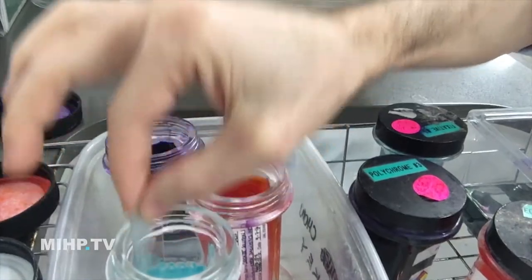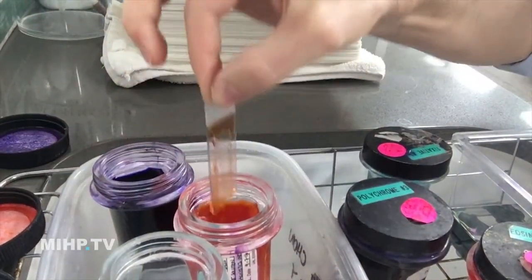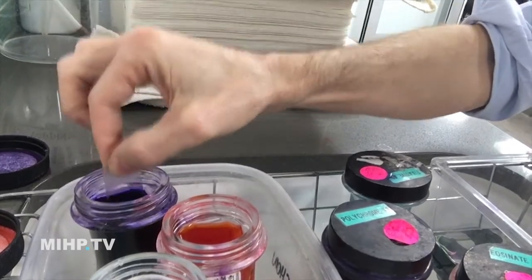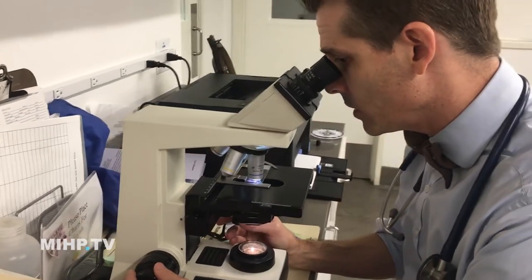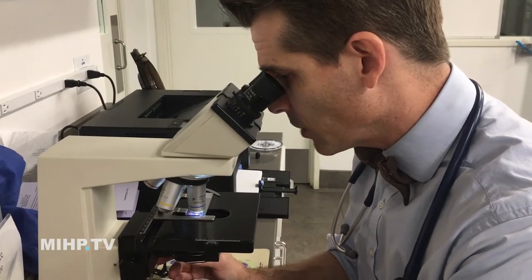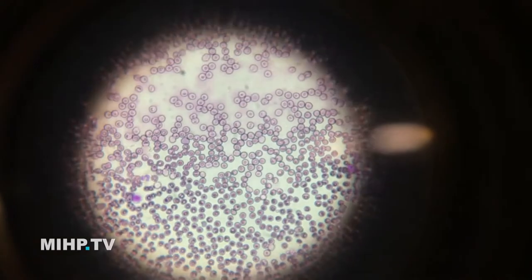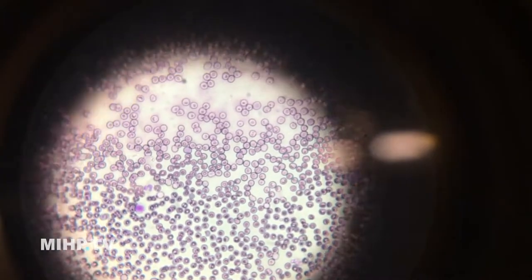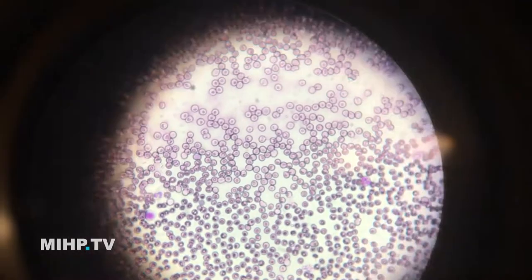So we'll look at it and see what it is. I'm gonna stain it. Oh, this looks like peripheral blood mostly. What is that? Just blood that you might get like in a vein or in a sore of some kind, so it might not be very diagnostic. We'll look at the chunky one that I thought was terrible.